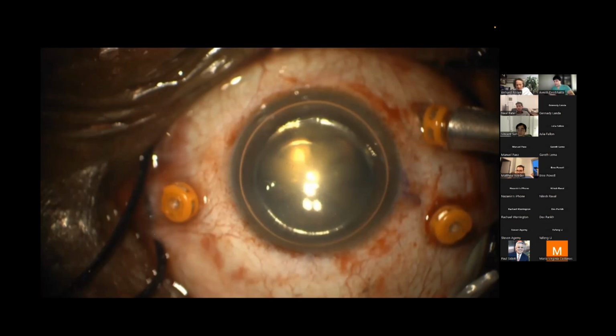So in these cases, I found that you can't just take the bubble out because it's basically going to just fill up again. I'll fill up the anterior chamber with Viscoat, and the view will come back. This happens in high myopes very frequently, and they're young phakic eyes. And I haven't had a real pressure problem with these post-operatively, amazingly.